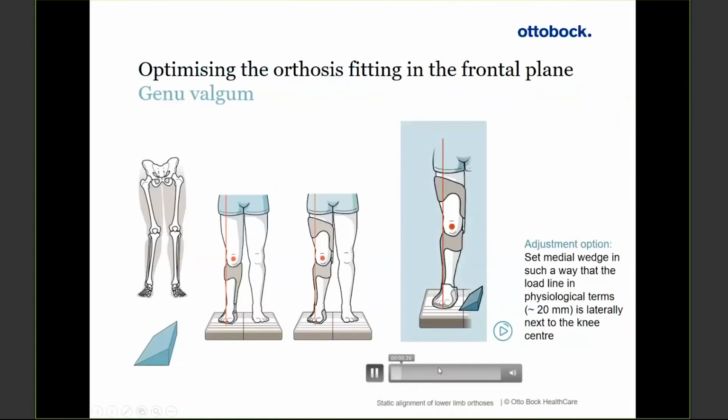So before we move on from orthotics, there's 3 main things. It really answers the question, why are the orthotic braces breaking? And then how has the alignment changed over time, and how do we capture that? And how do we have the patient approximate or have knowledge of what the proper alignment should be? And then the last one is documenting that for the future. And that's your orthotic interlude, Aideen.